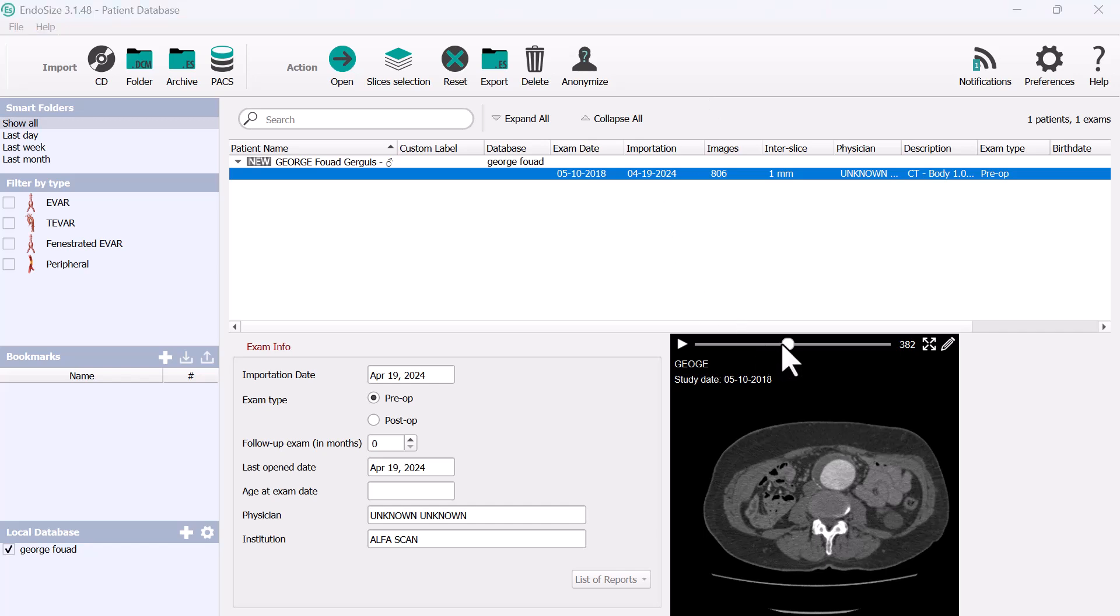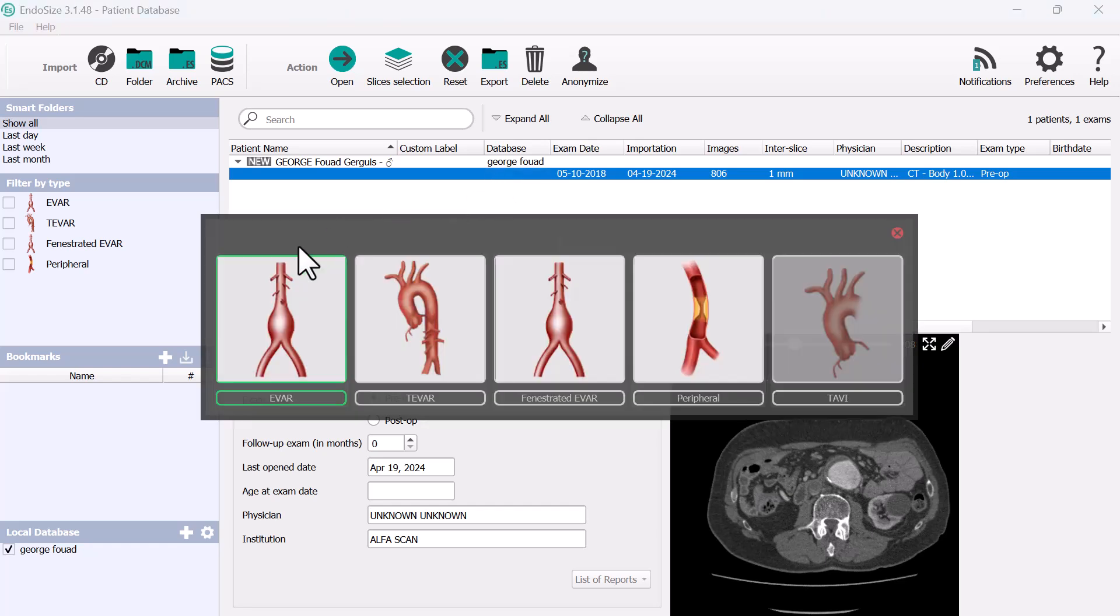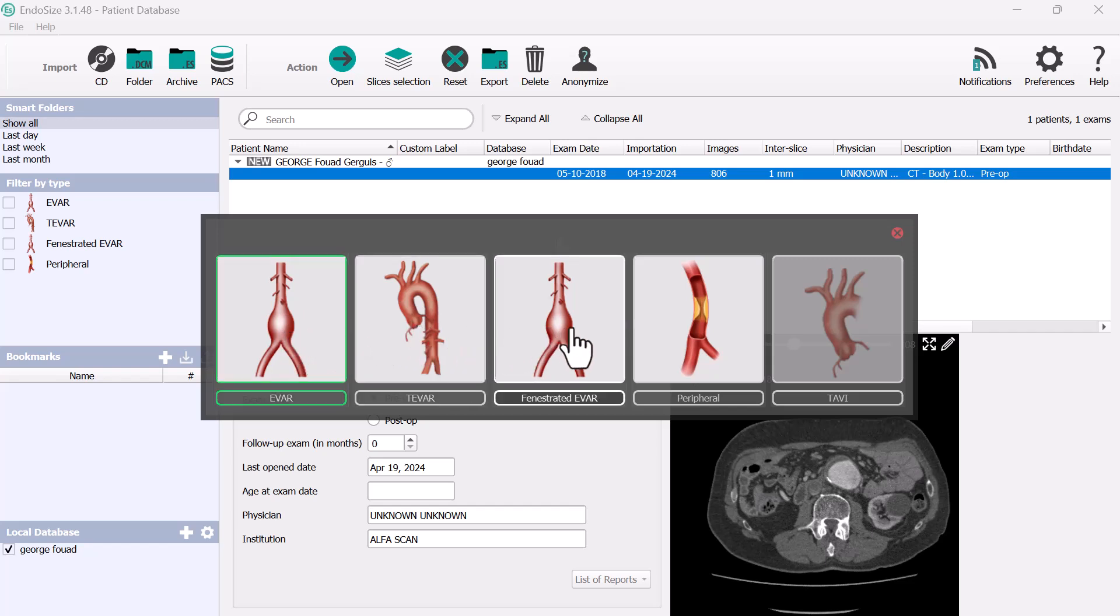If this is the patient and you want to open it, you double-click and then you decide if this is a patient of EVAR or TEVAR or fenestrated or peripheral intervention.